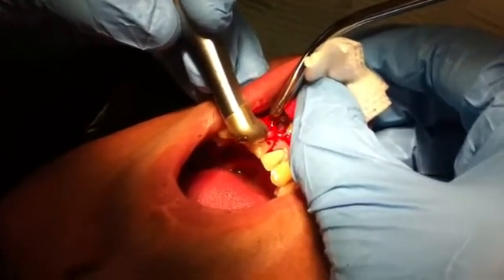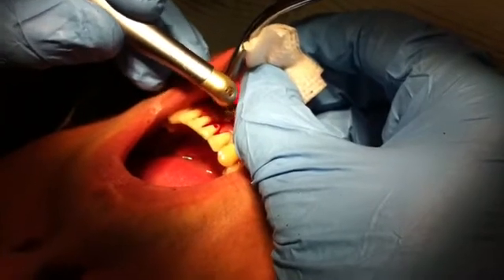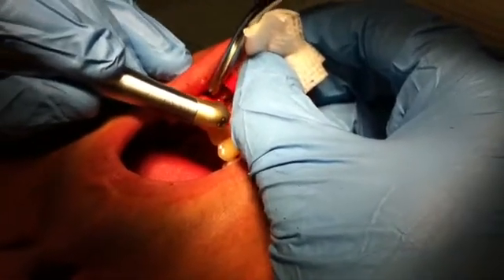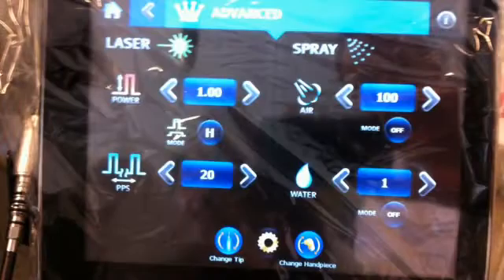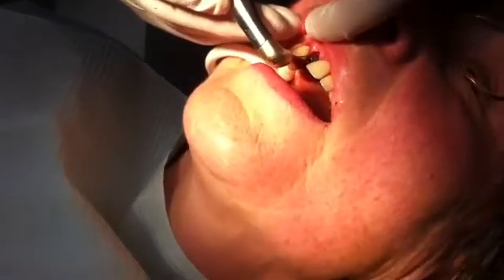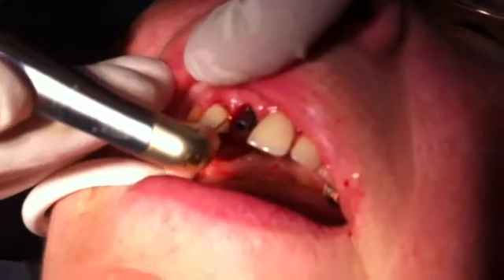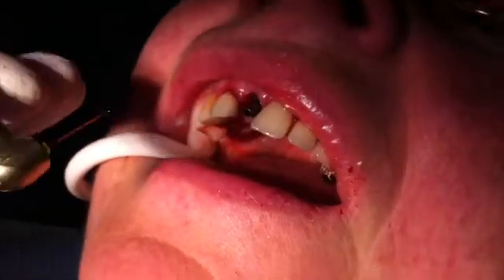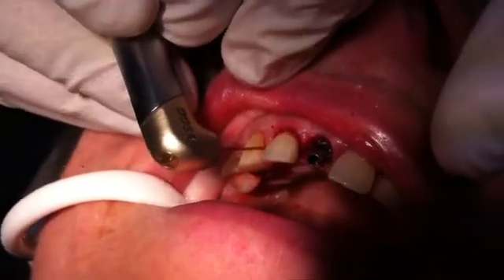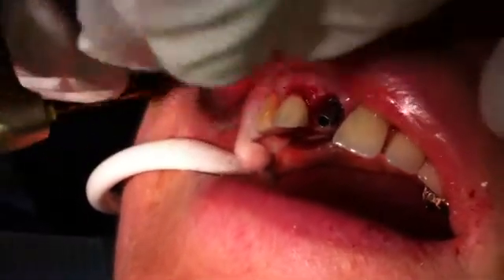Is that normally very vascular for you guys when you're cutting into that? Well, it's just bad — it feels all like that white. Now, the trick is you don't want to put a dry cotton on it. This isn't a standard case because the prognosis is usually very poor here.